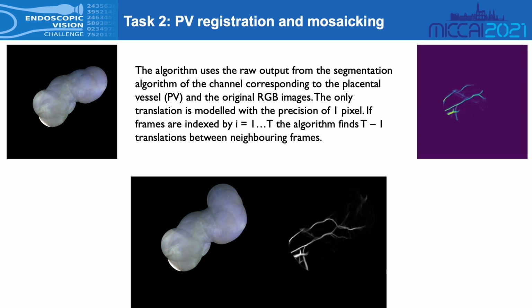On the left, you can see an example of RGB frame registration, and on the right, placental vessel registration. On the bottom, you can see the final results. Please note that we are the only team that solved this task. Thank you for your attention.